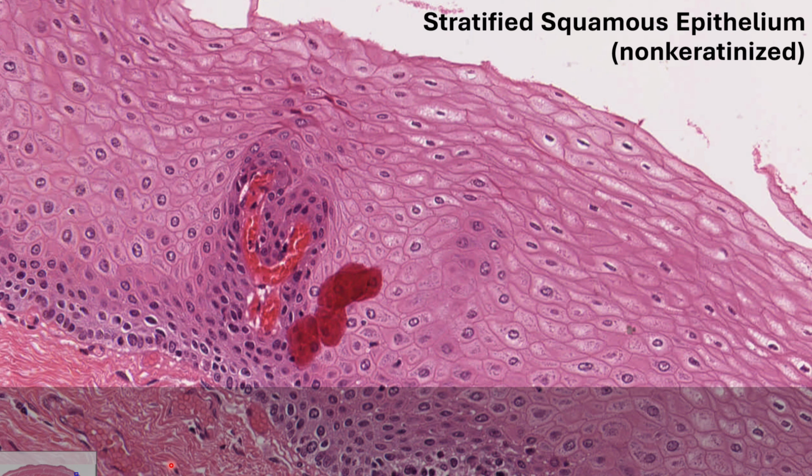We move from the simple epithelia to the stratified epithelia now. Stratified squamous epithelium is composed of several layers of epithelial cells on top of connective tissue. Note the shapes of the cells. The basal layer of cells is kind of cuboidal, while the apical cell layer is flat. Naming conventions in stratified epithelia use the apical layer for their shapes. Note also that while the cells are flat, they are alive in the apical layer. You can clearly see nuclei.